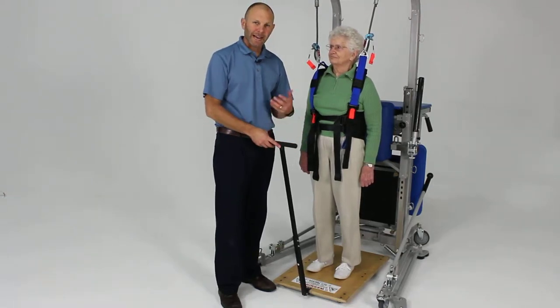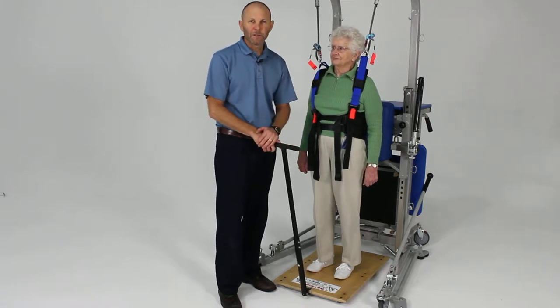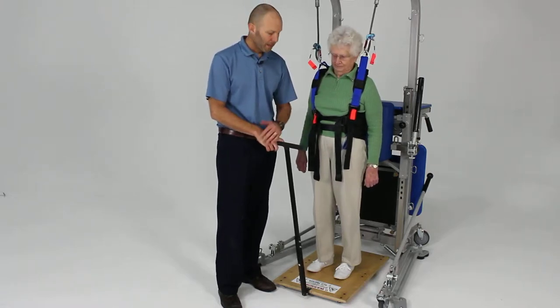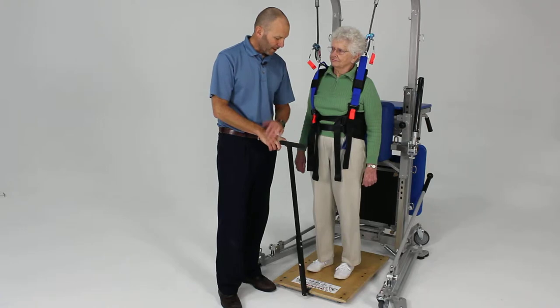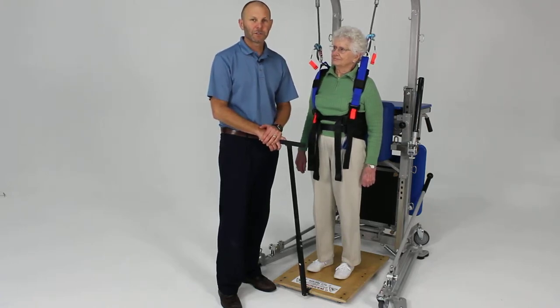Another method for inducing reactive type of posture responses is to use something called the slip trainer, which can be purchased separately. It's just a board that has wheels on it that we can move and provide these unanticipated challenges to balance.